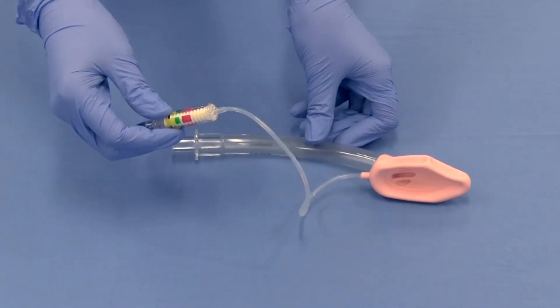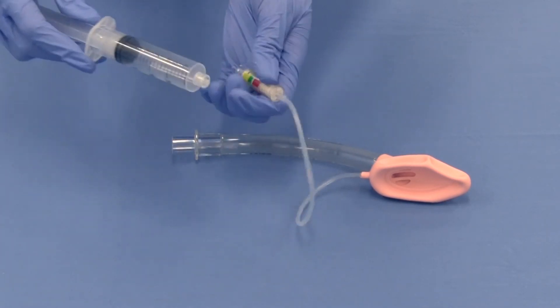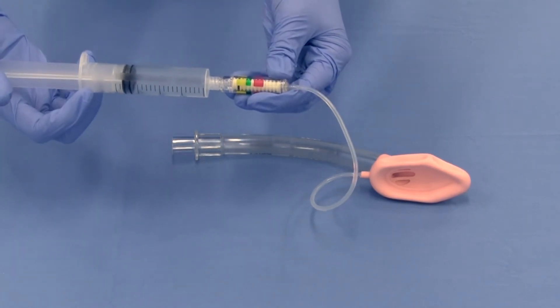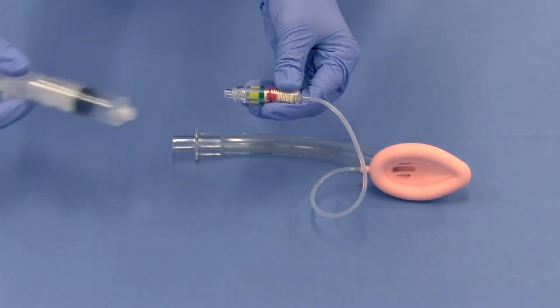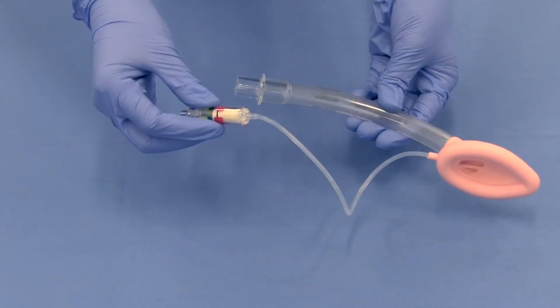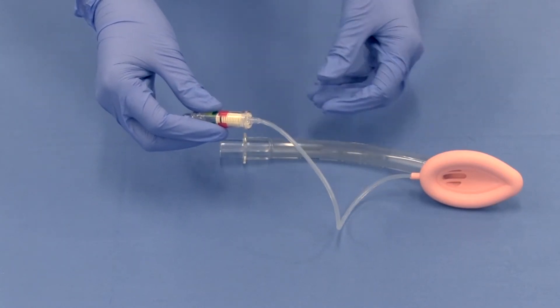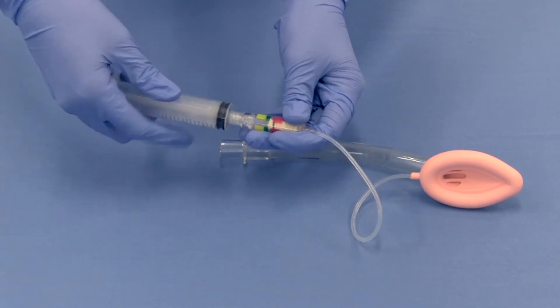Re-inflate the device to the red zone of the cuff pilot with a volume of air greater than 70 centimeters of water. Examine the cuff for leaks, herniations, and uneven bulging. If any indications of these problems exist, discard the device. A herniating mask may cause obstruction during use. Deflate the mask again.